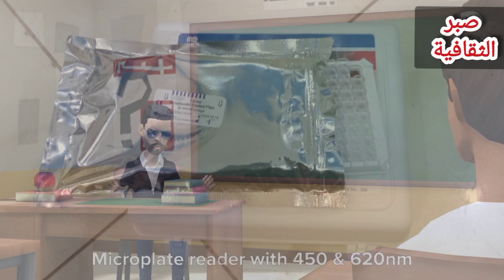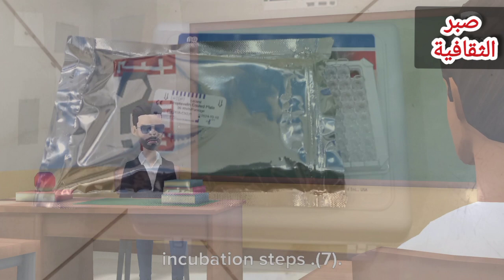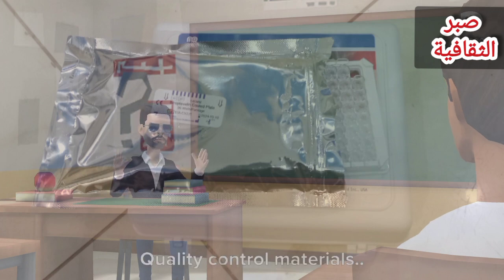Microplate washers or a squeeze bottle (optional). 4. Microplate reader with 450 and 620 nm filters. 5. Absorbent paper for blotting the microplate well. 6. Plastic wrap or microplate cover for incubation steps. 7. Vacuum aspirator (optional) for wash steps. 8. Timer. 9. Quality control materials.